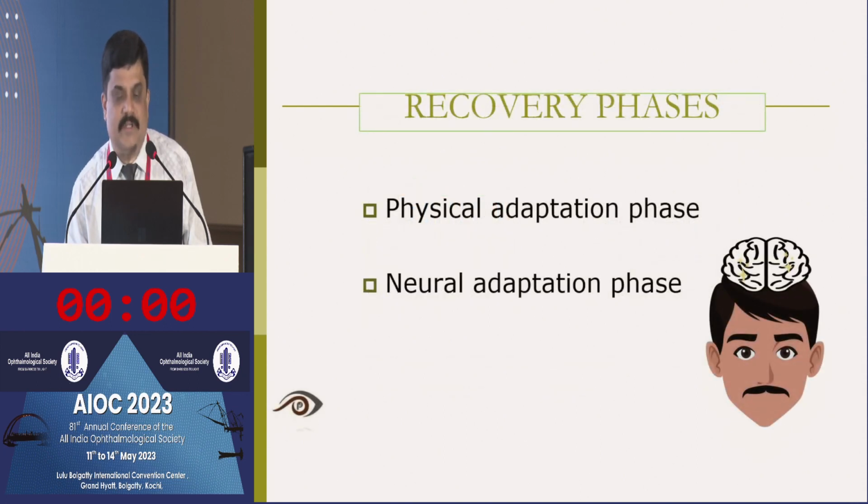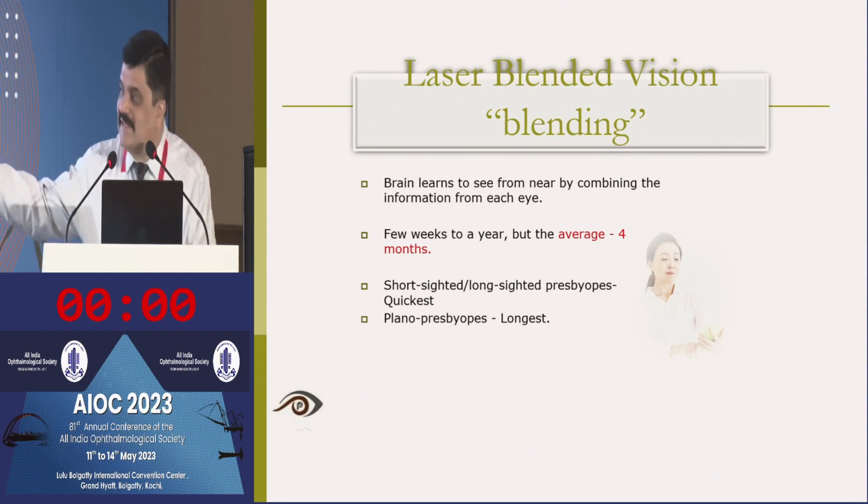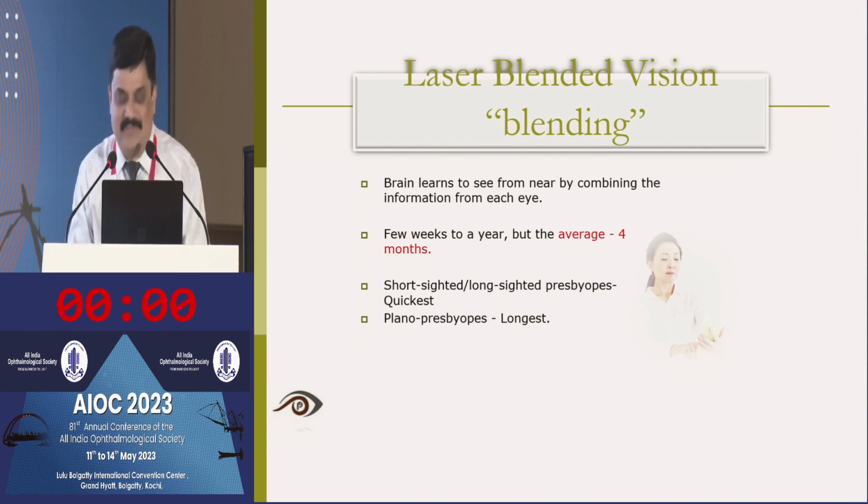This is about the recovery phase. It has a physical adaptation phase and a neural adaptation phase. Most of the patients recover immediately. I am happy to see Dr. Sri Ganesh, who was operated for presbyopia almost 7 years ago. Still he is very, very happy.